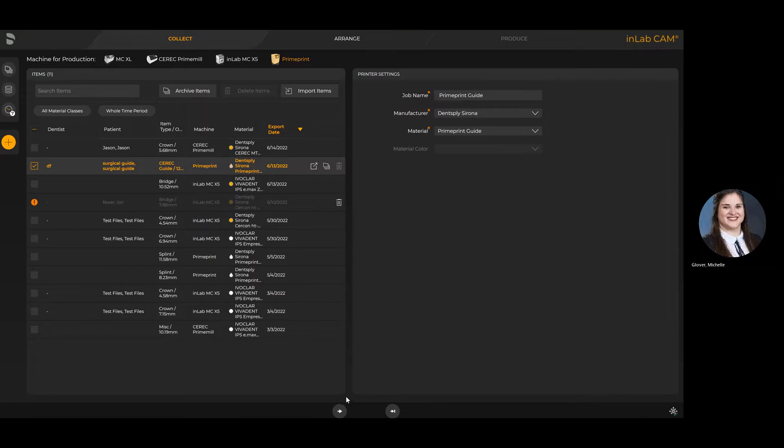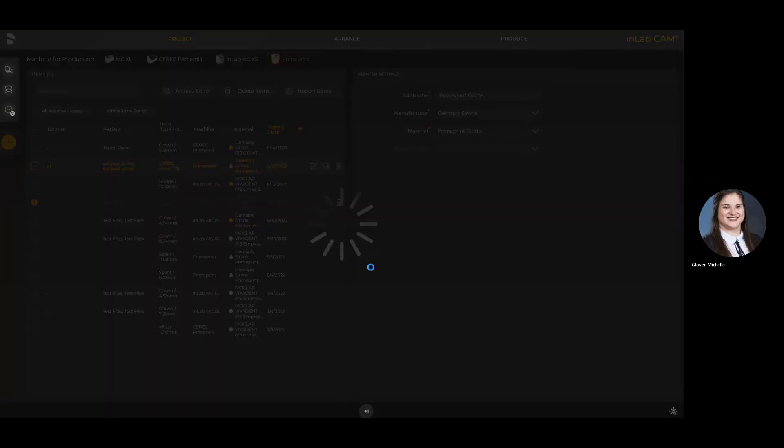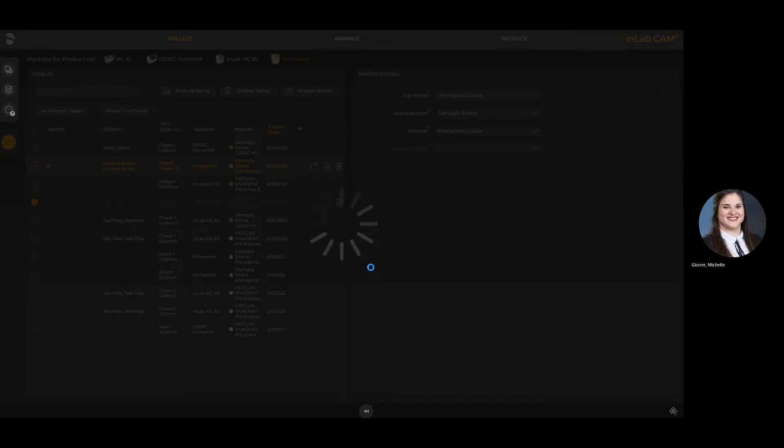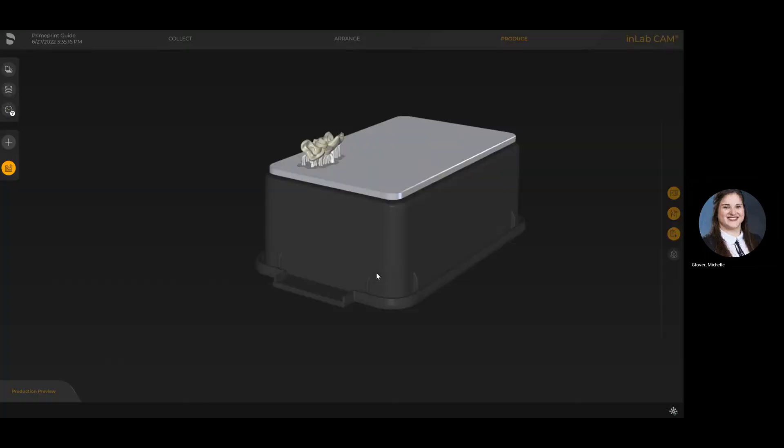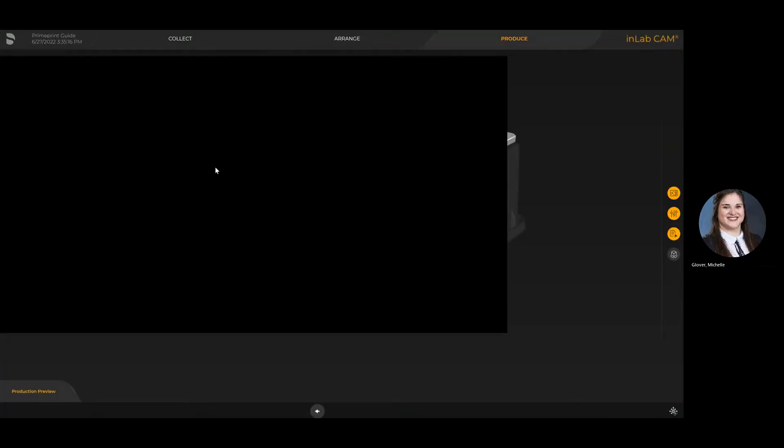On the bottom, if I were to select that arrow, that would move forward to the next step where I can arrange the actual job itself. But part of the beauty of InLab CAM 22 is the fast-forward option which I've just selected here. What the fast-forward option does is save a lot of working time as it pertains to nesting a case for printing.